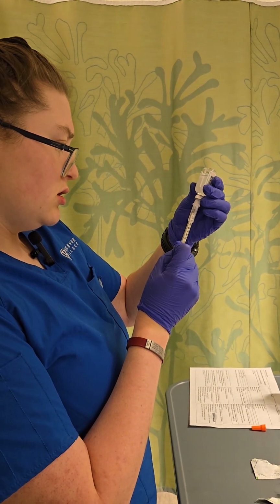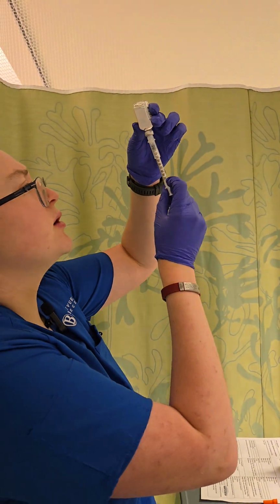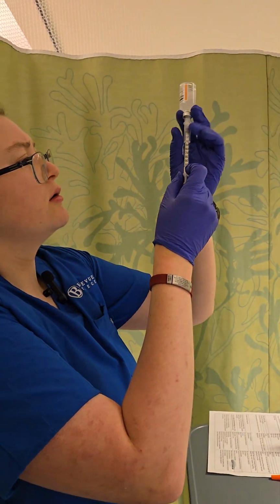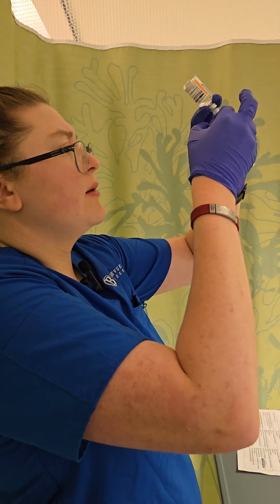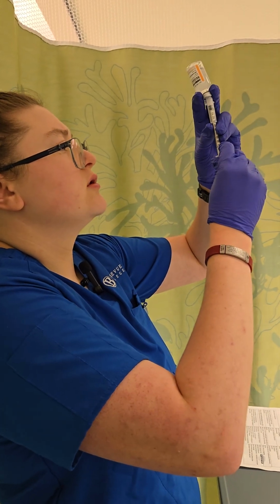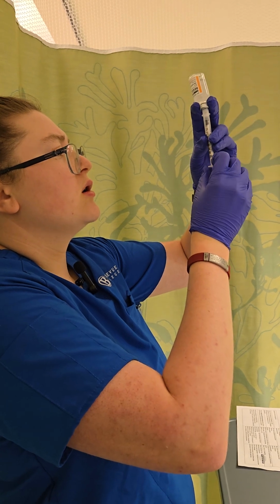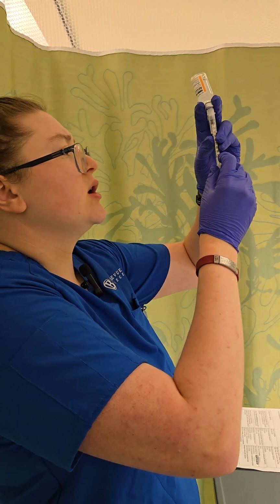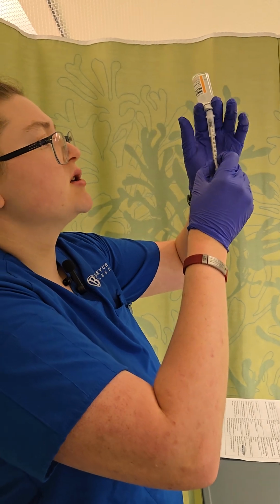7 units. Looks good. Holding up to the light to look for air bubbles. Tapping to get rid of air bubbles. Excellent. Air bubbles are gone, and I am at 7 units, a little above 7 units actually.